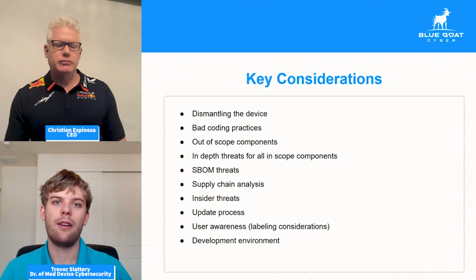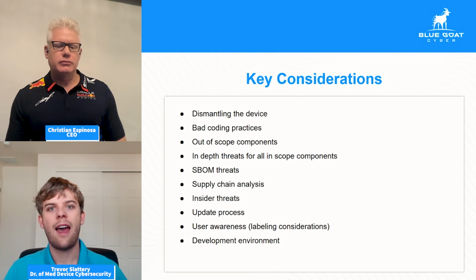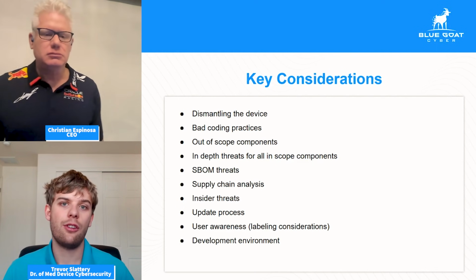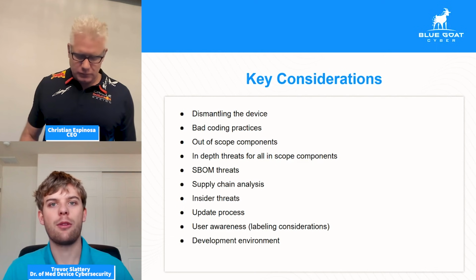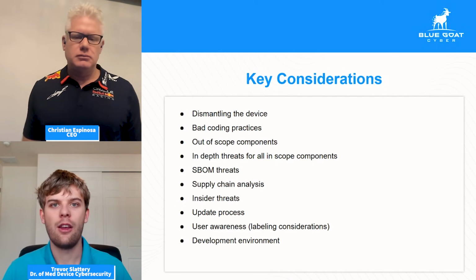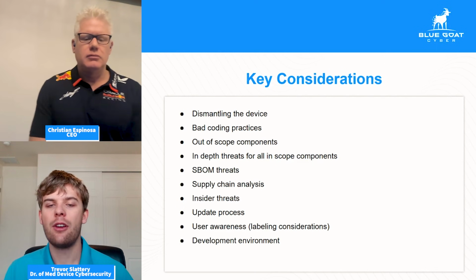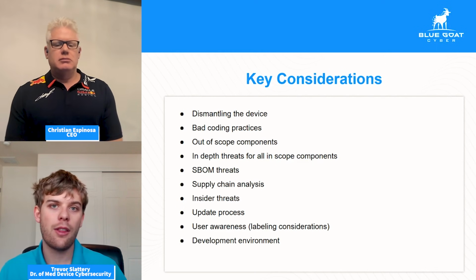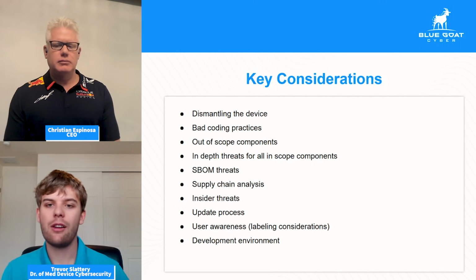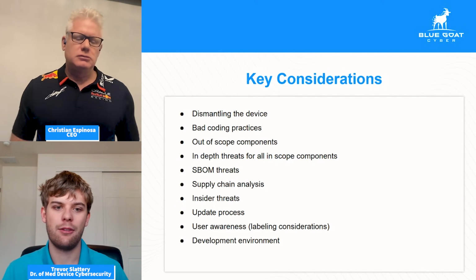Another thing that we need to think about is insider threats. This is an especially important one since it's not often easy to test. You can perform a red teaming exercise to assess your organizational security, but in a short-term engagement through penetration testing, there is no way to actually test what would be the outcome of this. So you have to understand what privileges employees have, who has access to this device, what they can do to the device, and what checks and balances are in place to verify changes to the device. All of that needs to go into consideration when looking at what can happen from an insider perspective.